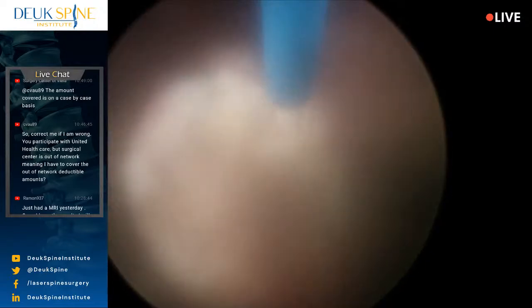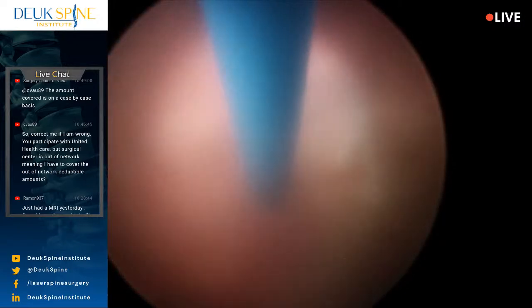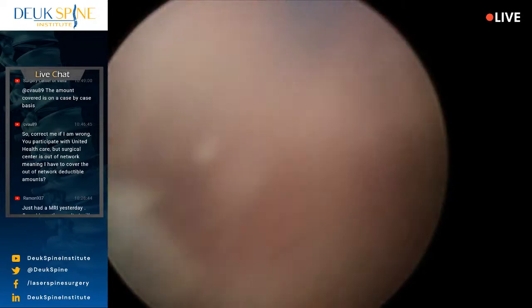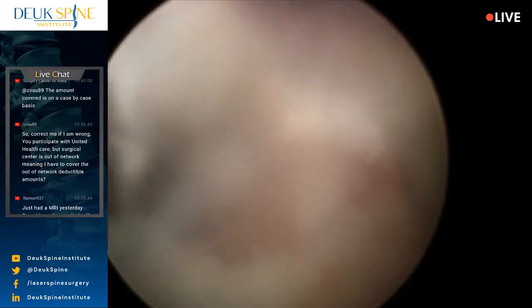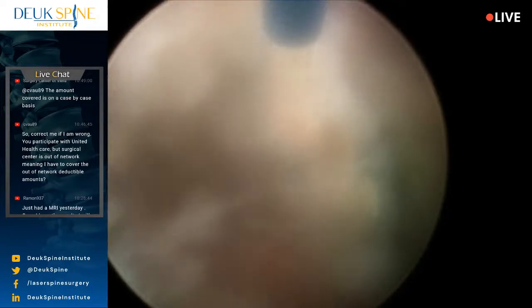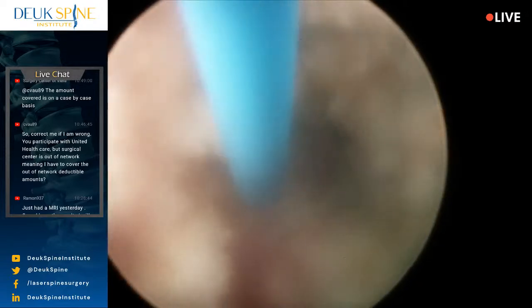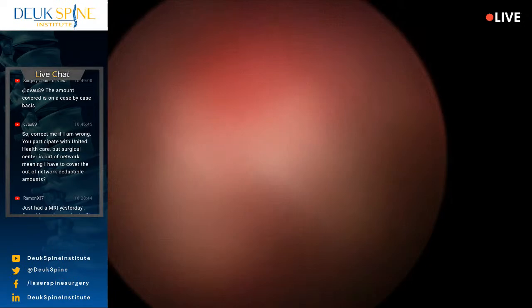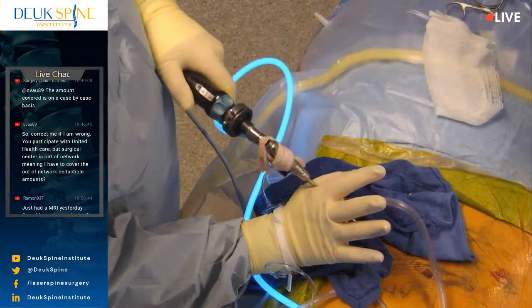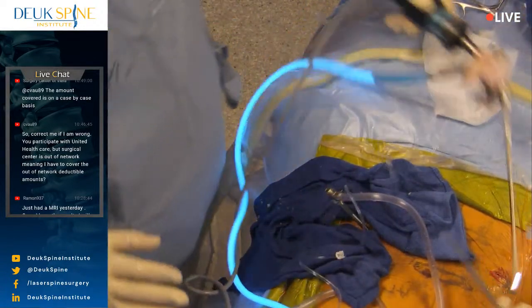All right, we're done here. Let me just see. That looks good. Sorry for the poor visibility. We don't normally have it, but again, there's a lot of inflammation going on in this patient's back, and that's why we're here. So, okay, laser off. We're done. Hope you enjoyed this surgery, and I hope I have some fresh coffee to drink. Scope off.